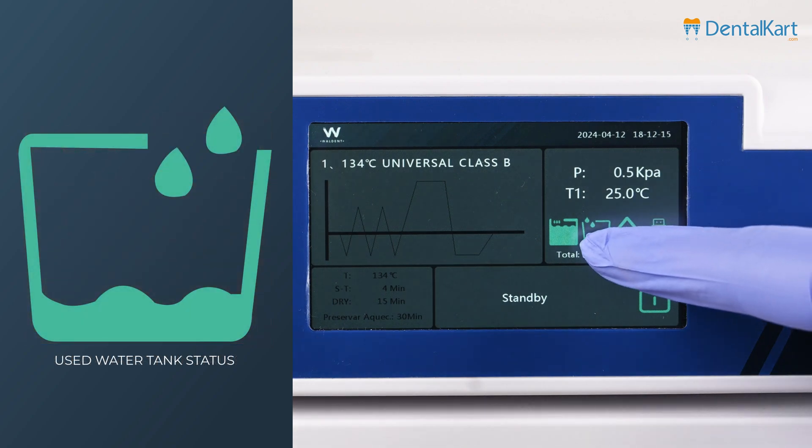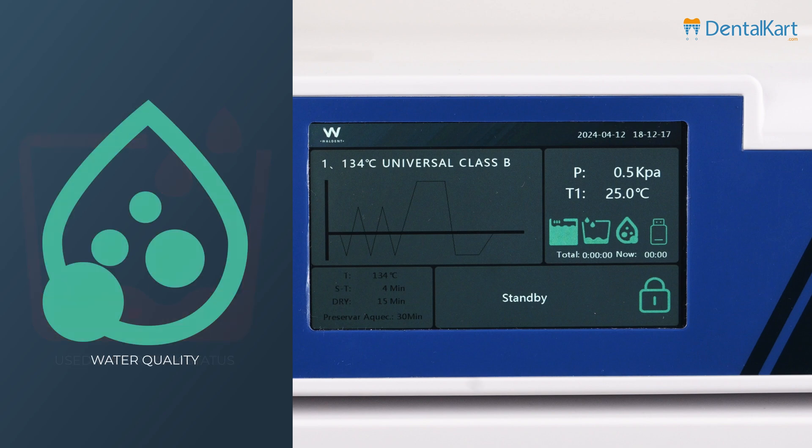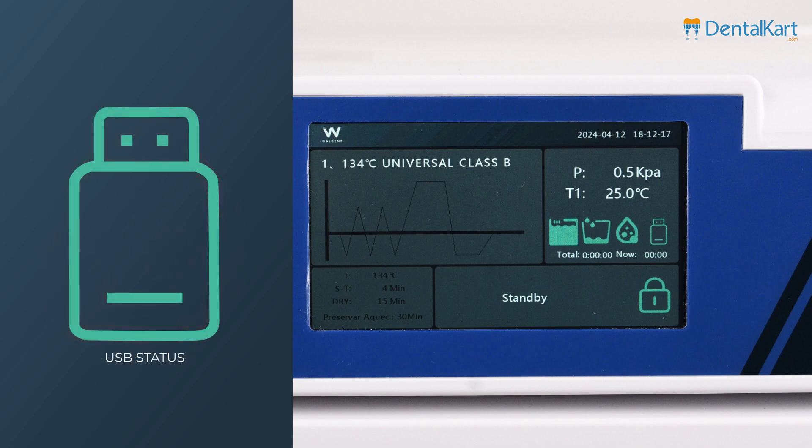The second icon is the used water tank status — green means the used water tank is empty, and red means it is full. Next is the water quality icon — green shows good water quality, and red shows poor water quality. The last icon is the USB status — green means the USB is connected, and grey means the USB is not connected.